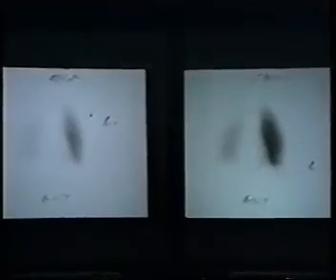Now, let me just back up for a second on that slide. This was a young woman who presented. She was Korean, and her single biggest problem was that she wasn't running the mile as well as she used to. And I would submit to you this is a perfectly normal chest radiograph. But someone took her seriously, and so they performed a perfusion and a ventilation scan, and you can see quite obviously that there is a mismatch, in that the ventilation and perfusion to the left lung is considerably greater than it is to the right lung.